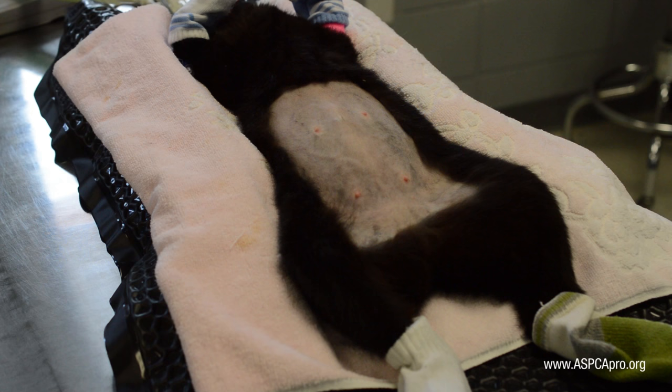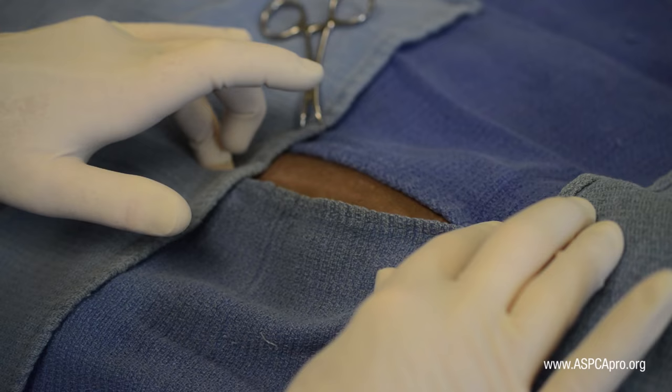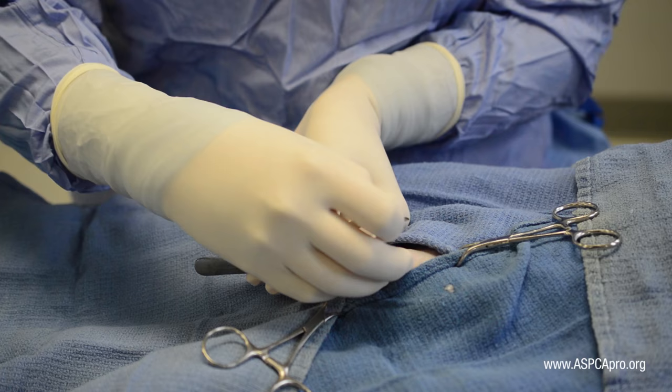The incision in female cats is centered at the midpoint between the cranial edge of the pubis and the umbilicus, regardless of reproductive status or age. The incision is lengthened symmetrically cranially and caudally as needed to accommodate the size of the reproductive tract.